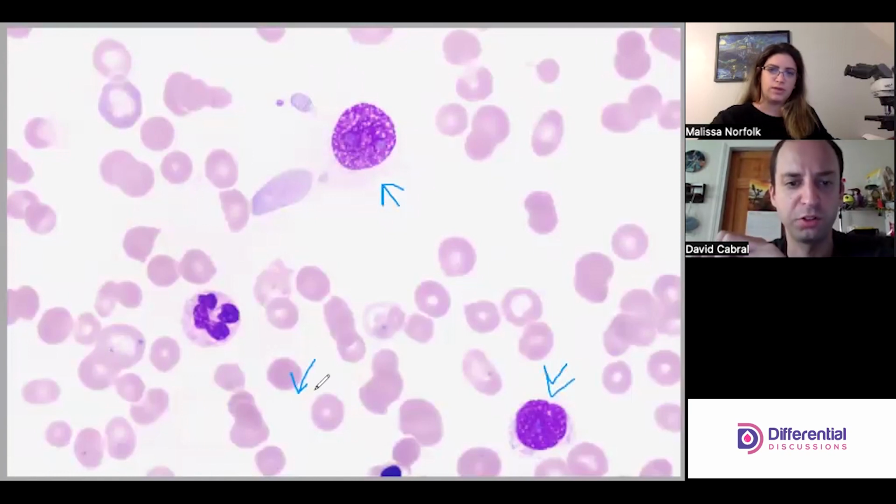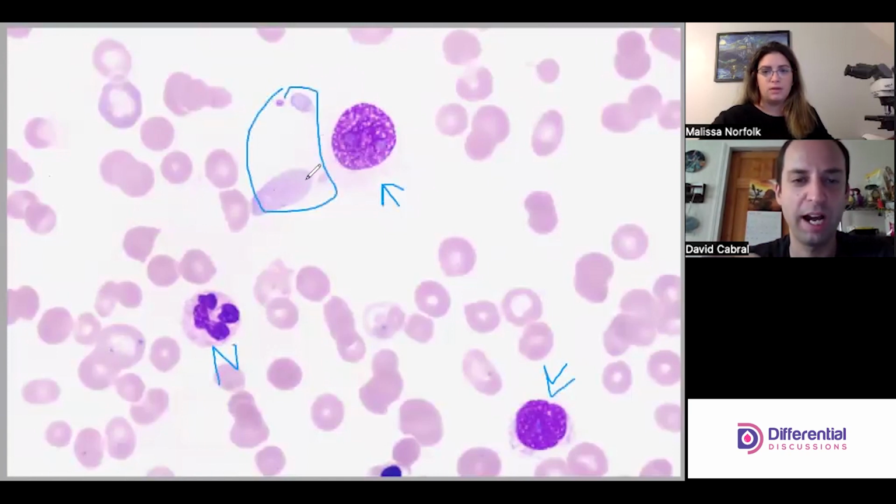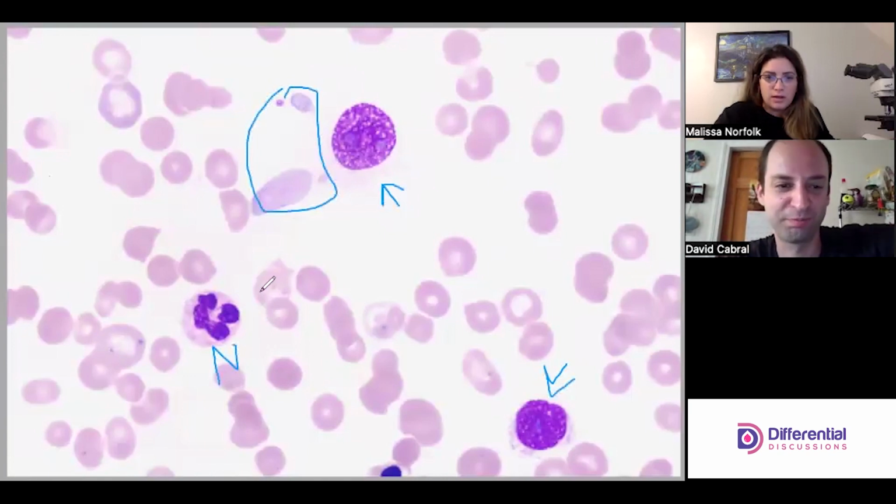We have some neutrophil. And then we got a neutrophil. Some of these weird platelets again. Oh wow, is that one a platelet? I thought that was a red cell. In the bottom, yeah, this one. Got texture to it, doesn't it?